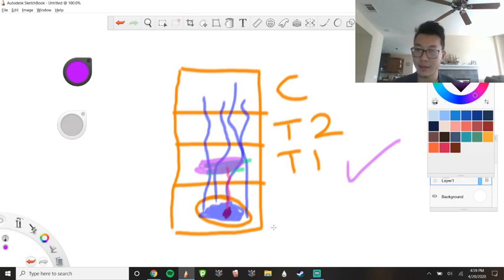Why are there two tests? Because there are actually two different types of pieces that you could have taken from that virus. So it's just to make sure that this test is super accurate. These two tests also give a little more information, which I'm not getting into now, about whether you had the disease before or you currently have it, based on which of the two light up. Again, not super important for right now.